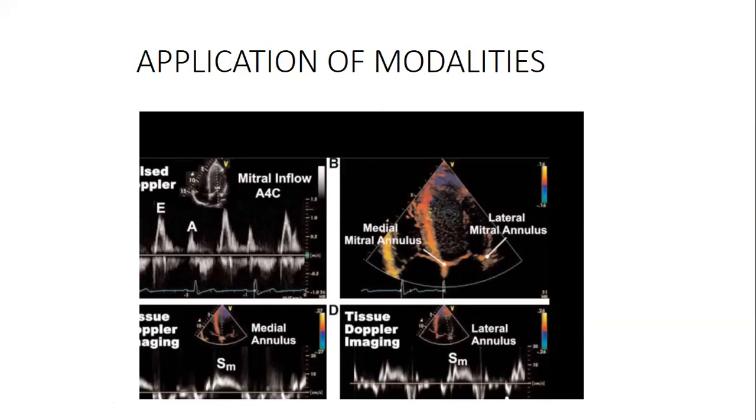So it simply means the ultrasound machine cannot determine the velocity and direction of that particular speed of blood. The velocities exceeding the Nyquist limit will be presented on the opposite side, like I was saying, and by opposite you can simply say on the negative flow. So that is all I can emphasize on that. If I'm not bringing it out, then we can have other contributions.